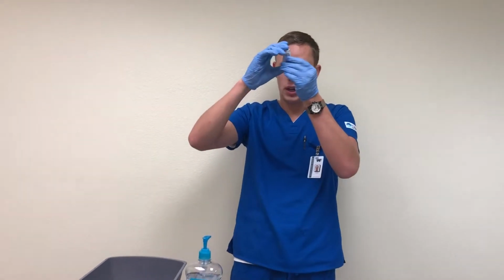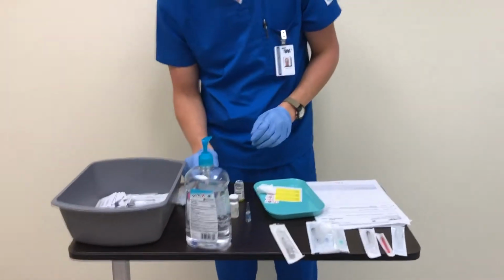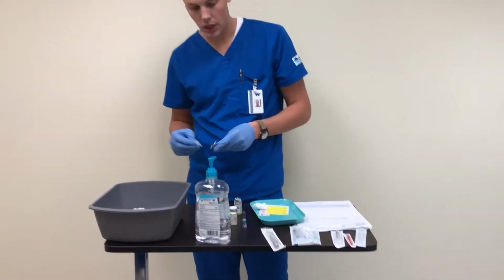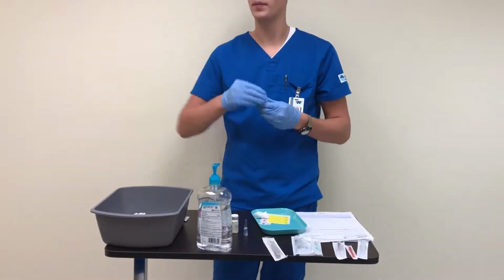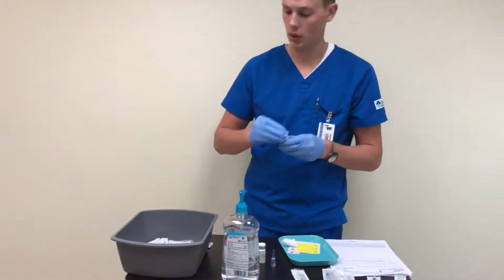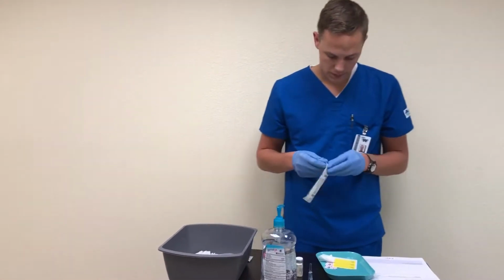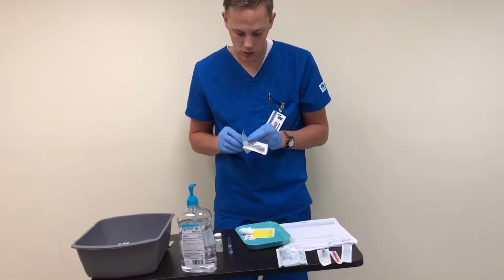Okay, and I just want to make sure I got no powder still in there. Okay, so that's ready. So I can get rid of that. And then I'm going to wipe down the vial again, because then I'm going to be drawing it up in the TB syringe. So again, this is for 10 to 15 seconds, just gonna wipe it down. And then we're gonna get our TB syringe out. And we're gonna pull out 0.1 mils, and this is a 1 mil syringe.